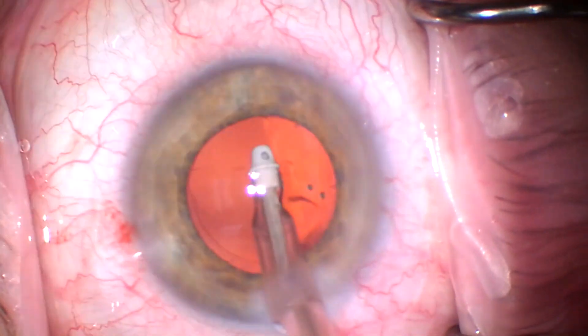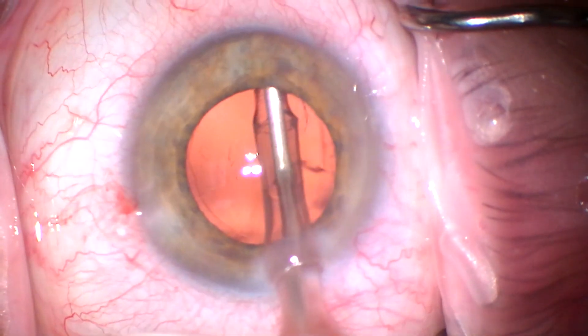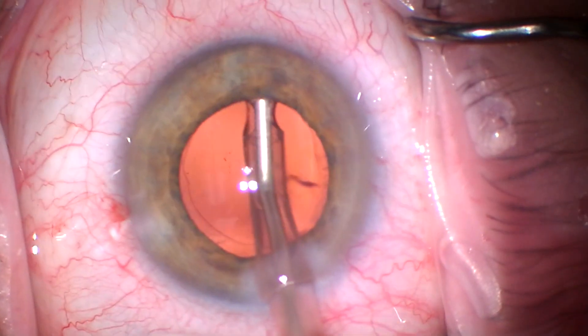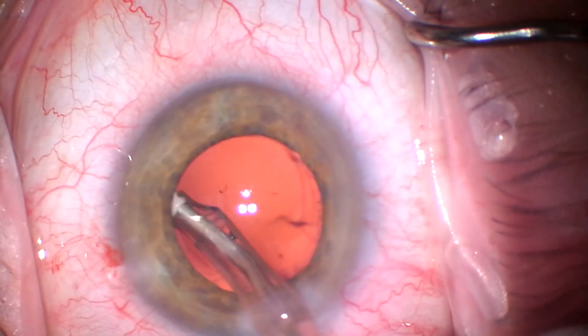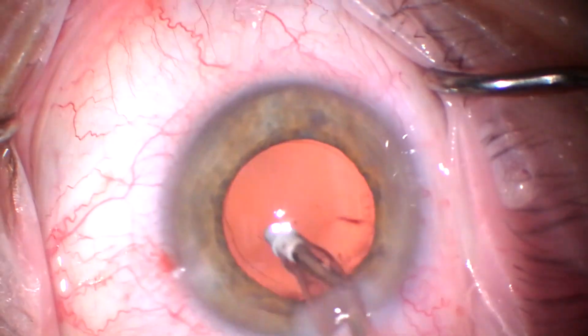Not much cortex here to remove, but I will go around and sweep underneath the anterior capsule. I definitely like to grab cortex from the anterior side — you get fewer strings that way.